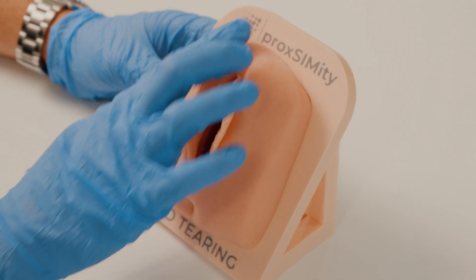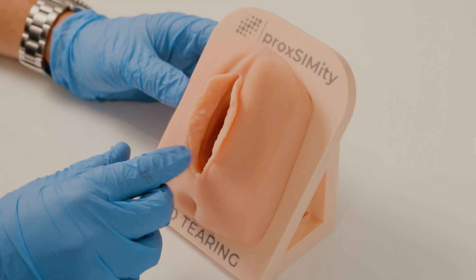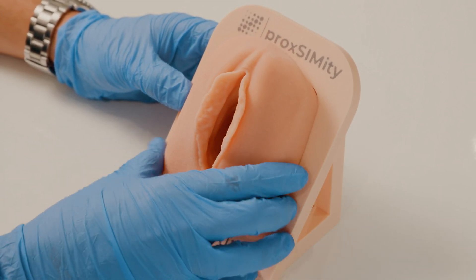We developed a special silicone formulation for our episiotomy models. They are really soft to the touch and yet super durable. Our models provide the most optimal angles for performing the perineal repair, which in turn leads to better patient outcomes and more skilled students.